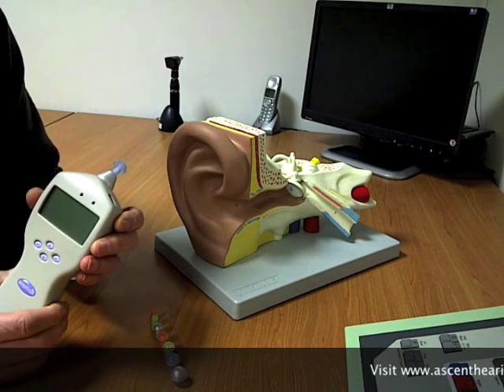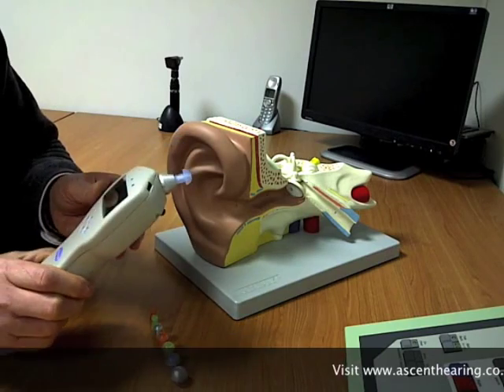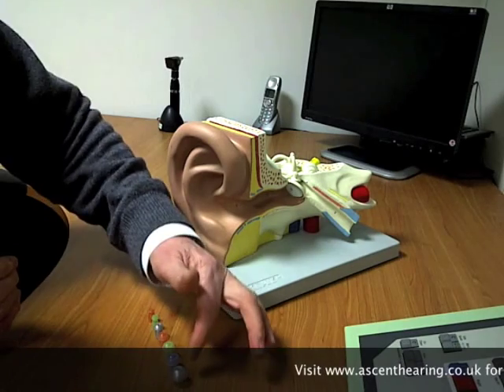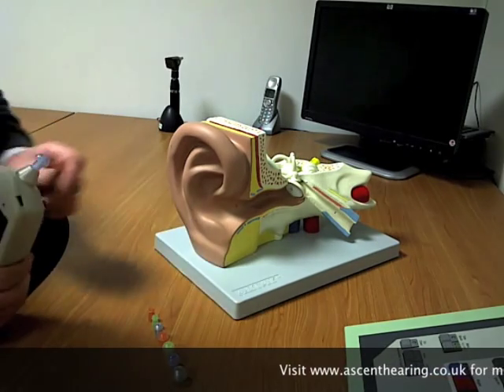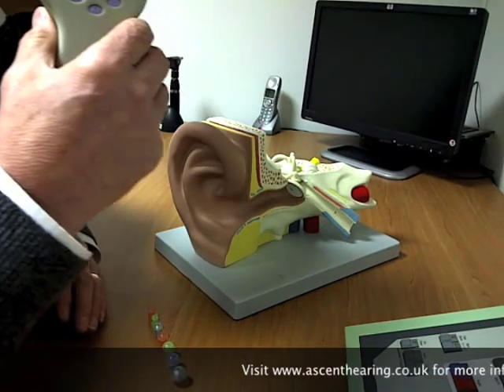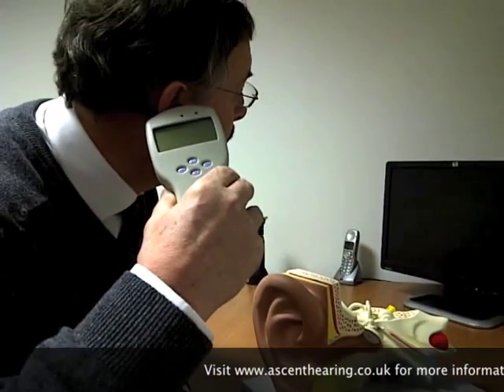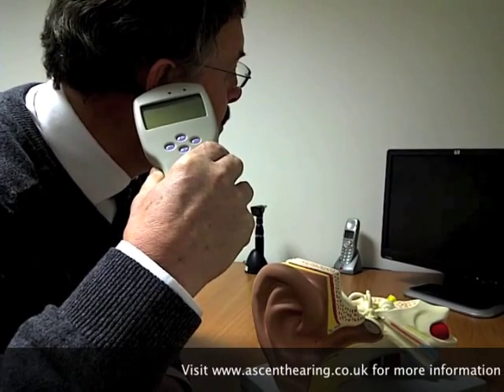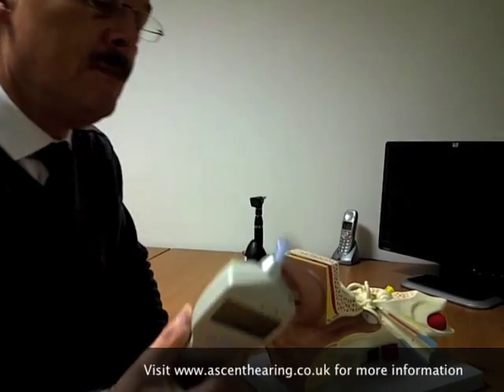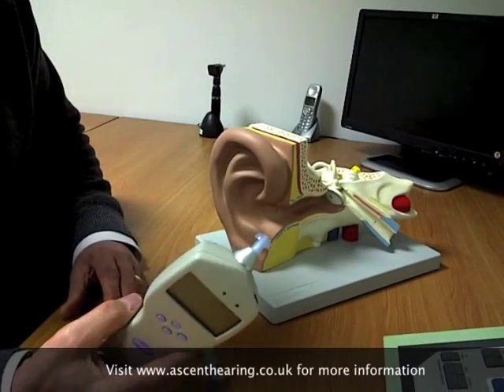This is an example of the piece of equipment used to do this particular measurement. It's handheld in this case, and on the table there are a range of mushroom tips which are placed into the ear. For example, on my ear the dispenser would set the piece of equipment so that it makes an airtight seal in my ear canal, and once that's achieved the test can be carried out.